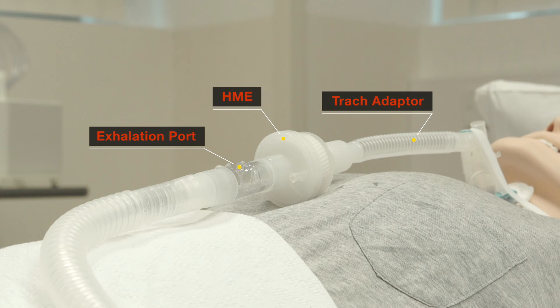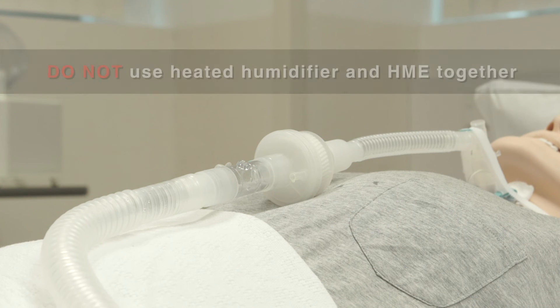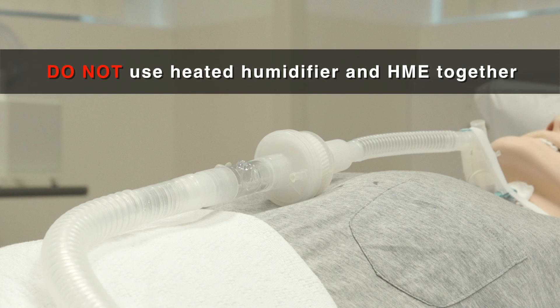Ensure the connection sequence is in this order: exhalation port, HME, trach adapter, and to the patient. Do not use the heated humidifier and HME together, as excessive water in the HME can cause blockage.